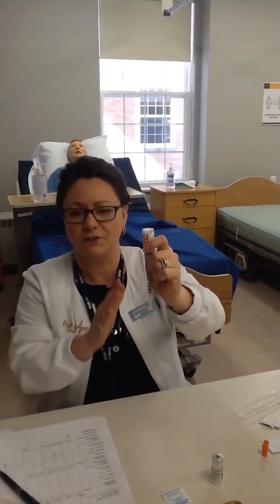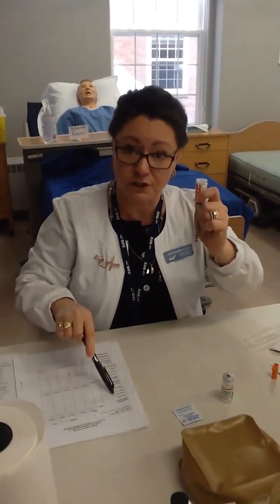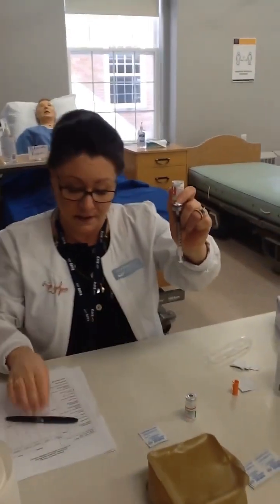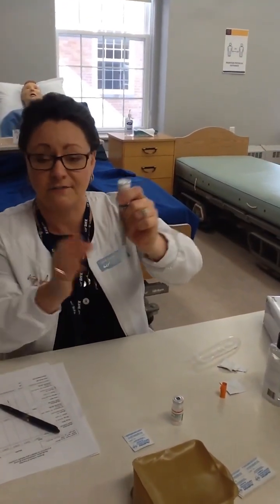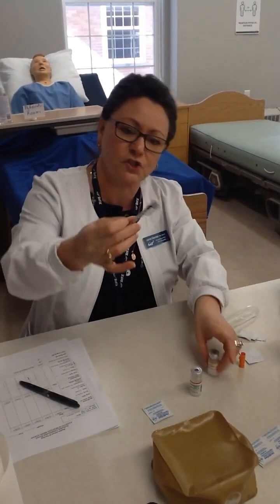the vial. The vial is right on top of the syringe. The second nurse can come over here. The second nurse can look at this medication administration record and see that that's insulin R. June is holding insulin R. The MAR says 6 units. June has 6 units. That's safe and good to go. So I can go ahead and set everything back, pull the needle up out of there nice and straight.